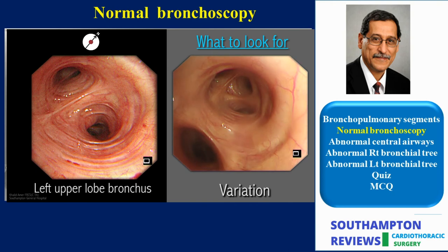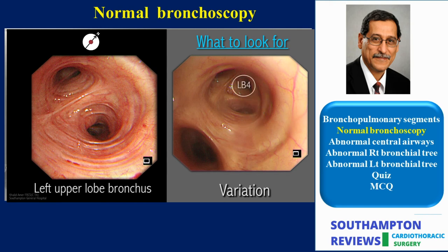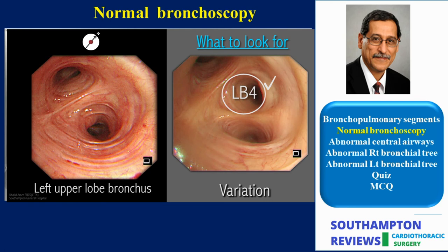On the right screen, the upper lobe is showing three divisions instead of two, and the middle one is confusing — should we call it superior segmental of the lingula Lb4, or anterior segmental of the upper division Lb3? Only when deciding where the tertiary carina is does the anatomy become clearer. C3, which divides the upper division or trisegment from the lingula, is higher and more proximal than the next level in the hierarchy of carinae, in this case C4. Subsequently, the upper left orifice has to be the upper division or trisegment, and everything else is the lingula — making the middle orifice part of the lingula, i.e. Lb4. This becomes even clearer when the view is magnified and the hierarchy of the carinae is well established.